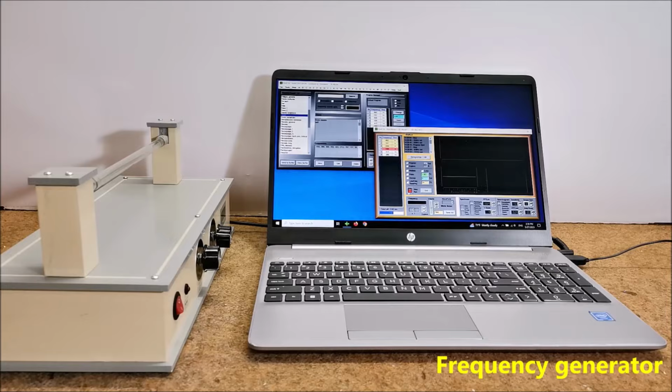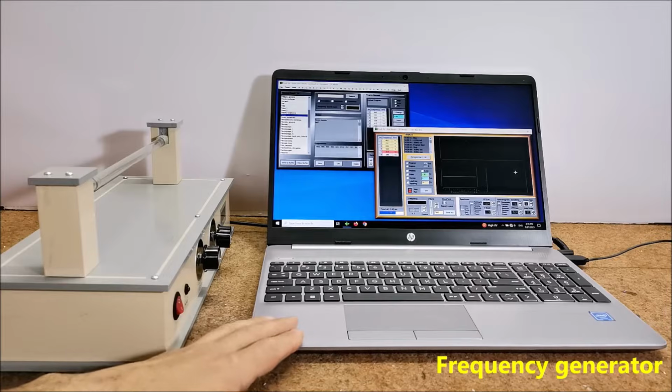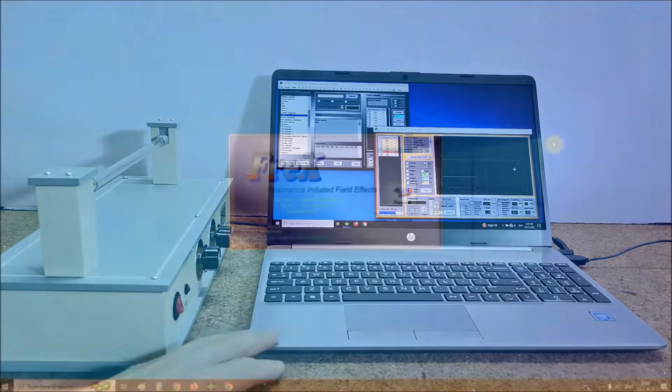Also, we can choose different shapes of the signal, such as sine wave, square wave, triangle wave, sawtooth positive and sawtooth negative. It has also the white noise generator. In practice, rectangular and sawtooth negative are mostly used. In the video, the method of installation and use is described in more detail.